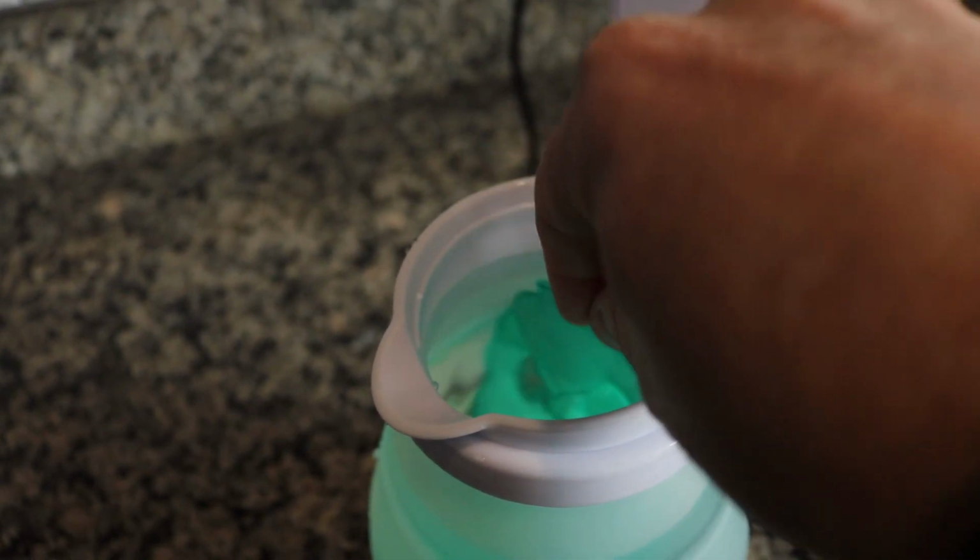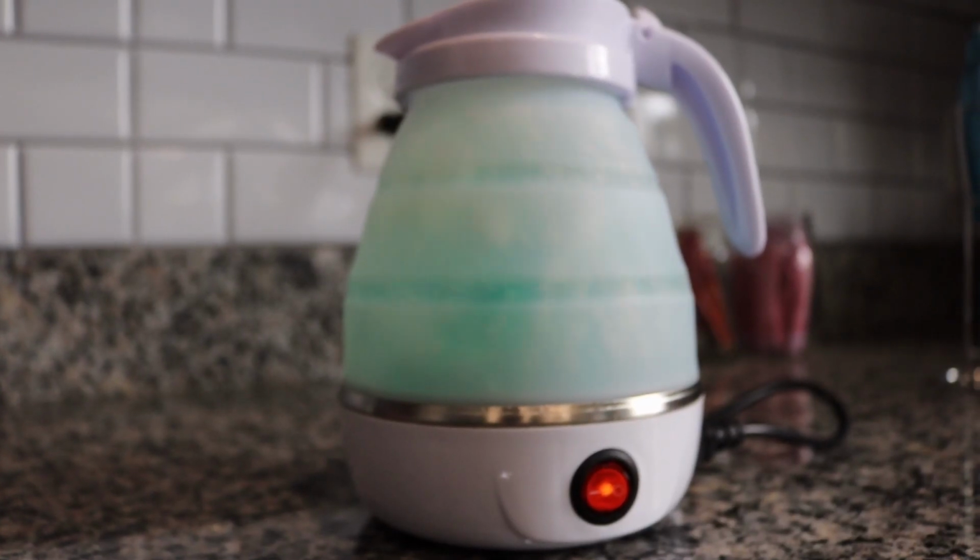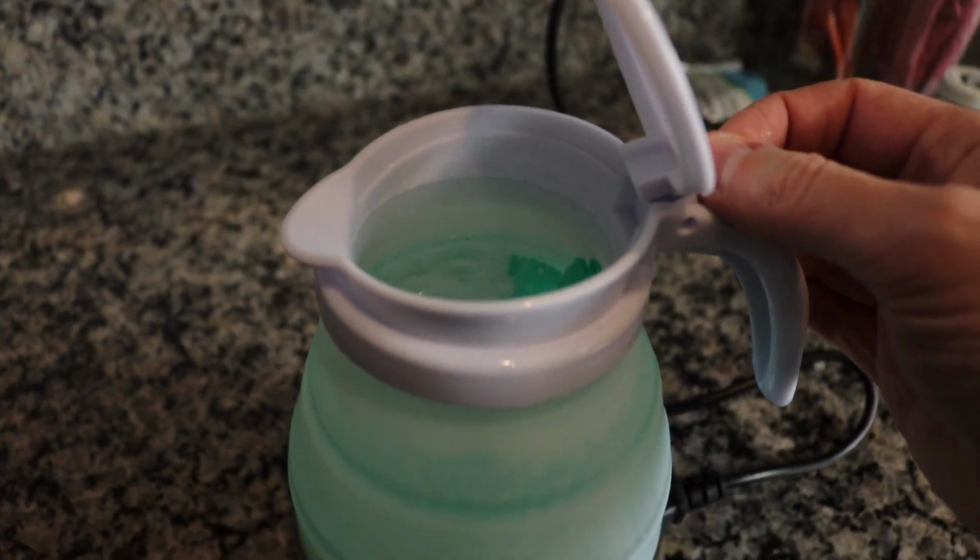Now when you're ready to actually activate or reactivate the gel inserts, you do need to boil them, and it will bring it back to its fluid state, so then you can use it again later.